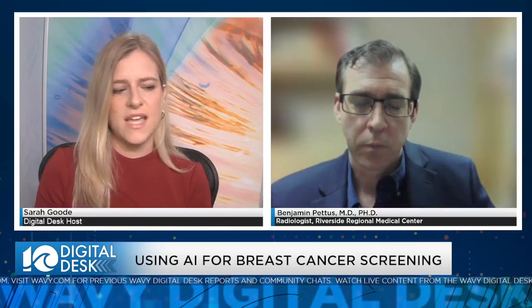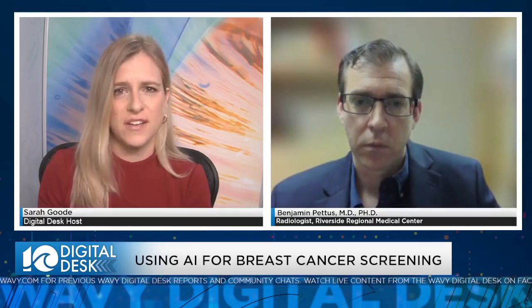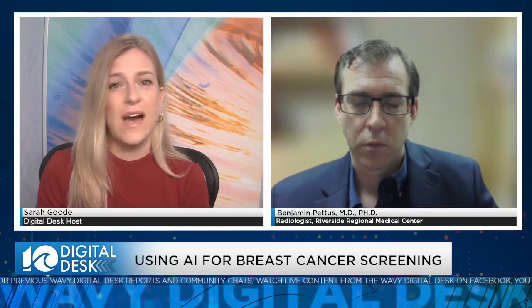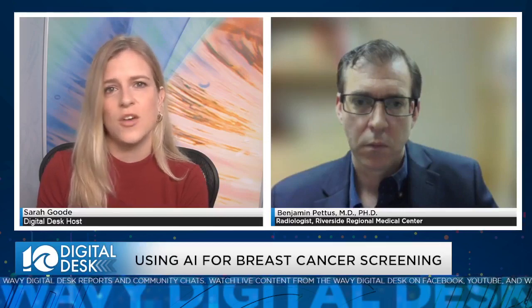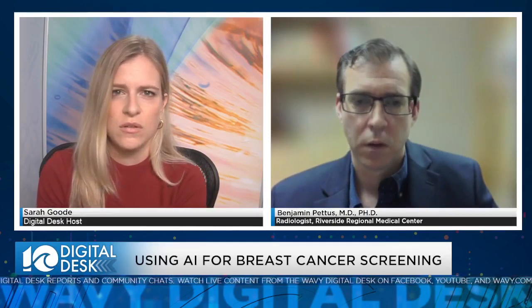So really in this case, you call it a second set of eyes, but it's really an extra check just to make sure you have one more tool in your arsenal to see if there's anything outlying, if you will, on the test, or something that maybe you didn't catch, or just sort of an extra boost that this passed, or this didn't show anything abnormal.